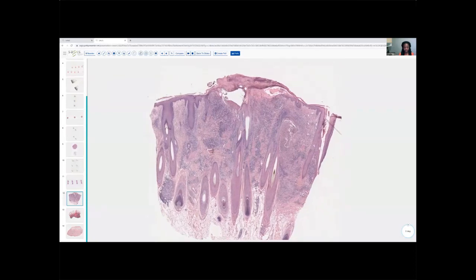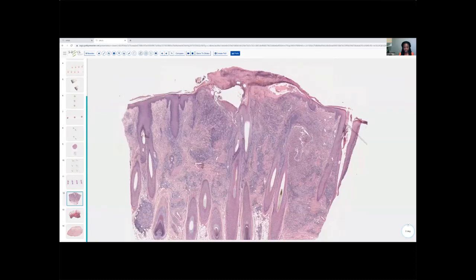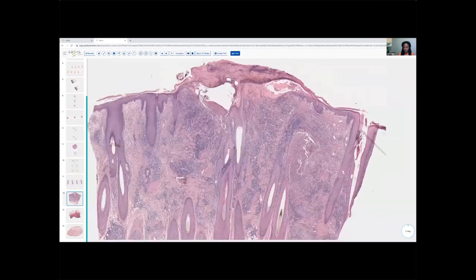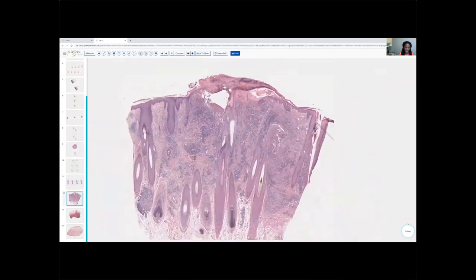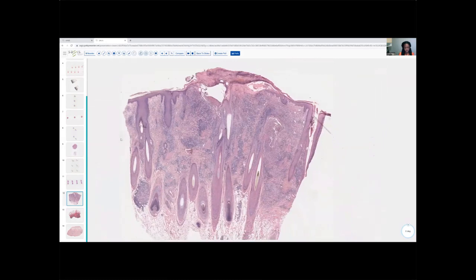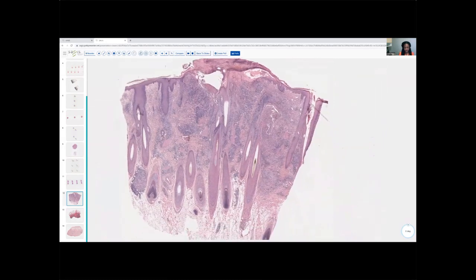We just don't have the epidermis maintained here, this kind of pustular zone which has caused some ulceration, overlying again this particular group of hair follicles. What's so interesting about it is that this inflammation is really, really dense.